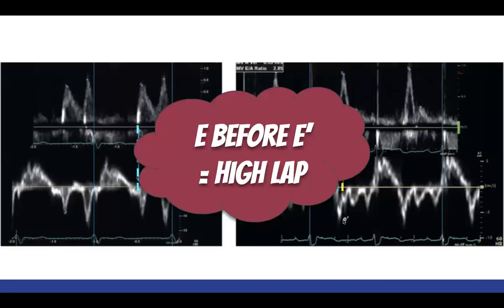But just to finish this one, based on what is written in the guidelines, it seems that they don't recommend measuring this too often. Unless you're totally confused and this is the only thing that can help you, you should probably check it. But from what I understood, it's usually very tedious and you can get most of the information without it.